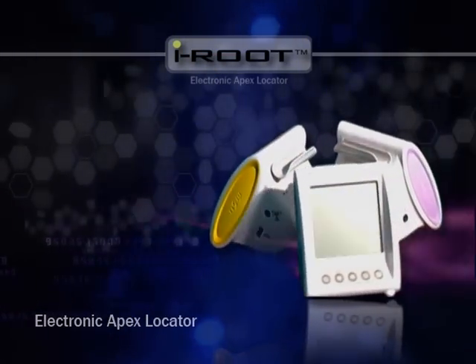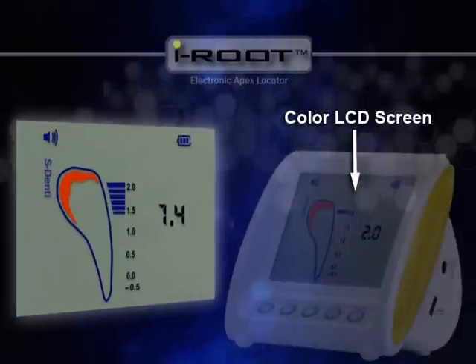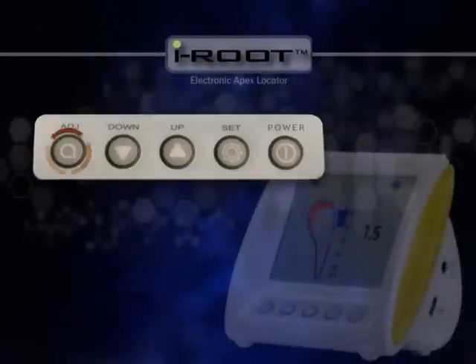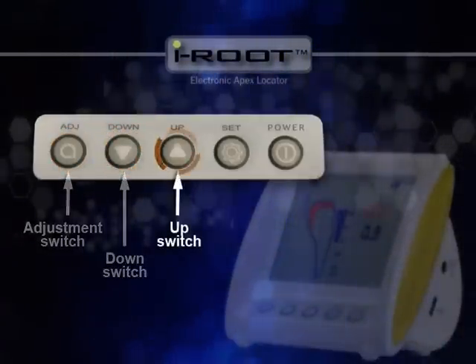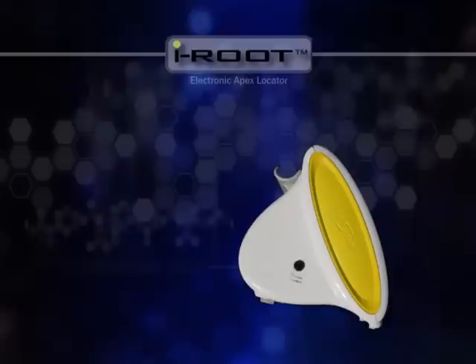Let's check out iRoot's appearance and parts. On the front is the color LCD screen. The button panel has ADJ, down, up, set, and power buttons from left to right.